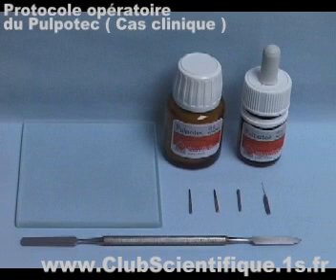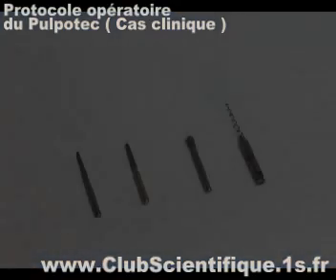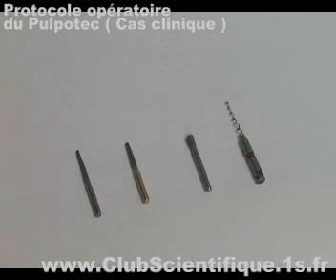The first case is on a very decayed but still vital tooth number 17, where accessibility is poor and on which a temporary protective obturation has been placed.